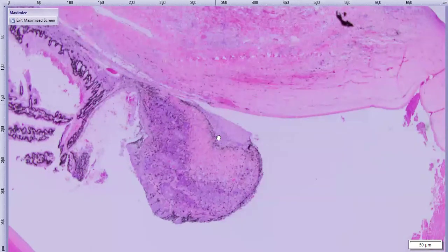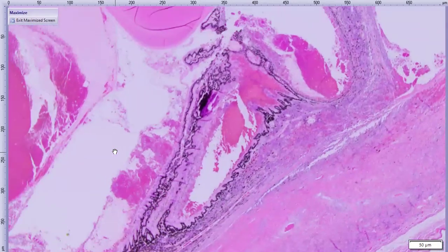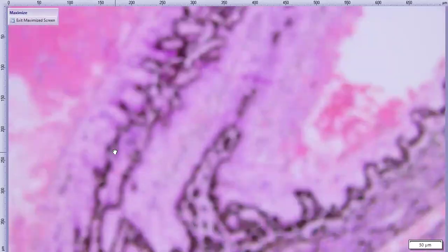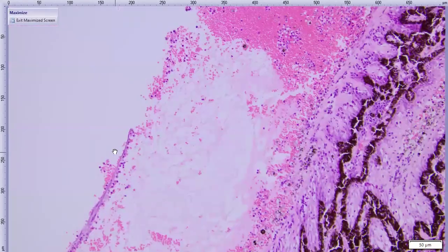Over here, same changes, just that membrane is kind of grabbing on to the margin of the iris and pulling it forward. So we have this ectropion uvea. It's kind of making this funny little nubbin of an iris. And then as we move back, we have similar cells throughout the uveal tract. We don't need to look at them too closely, just more lymphocytes and plasma cells.